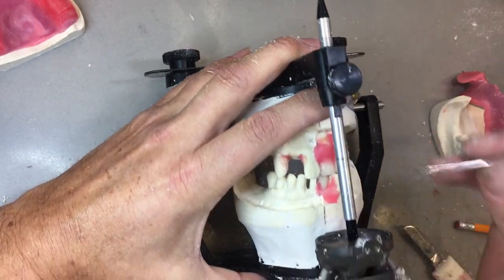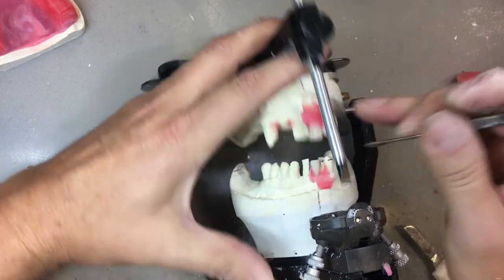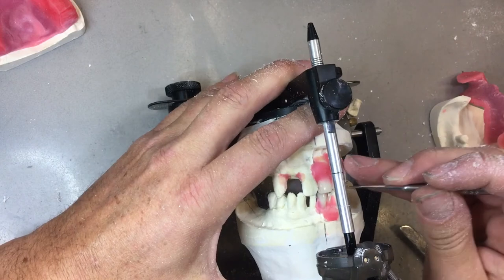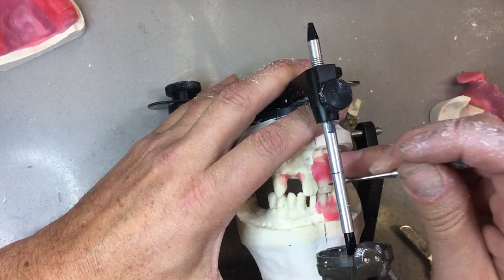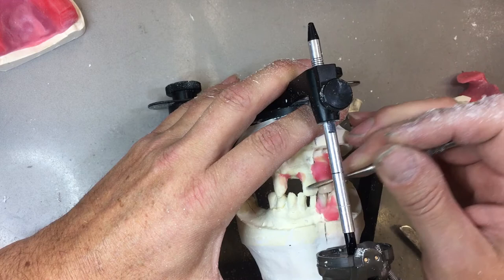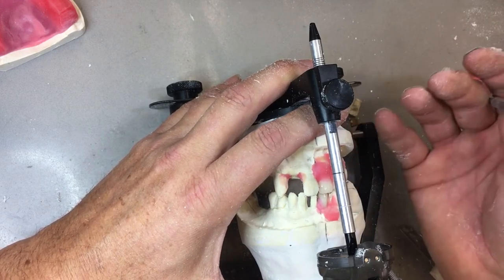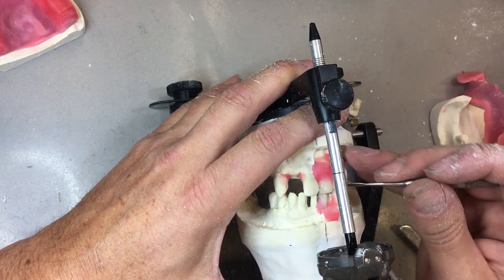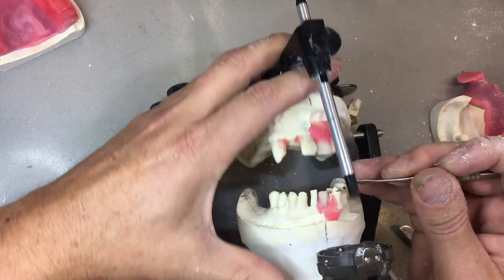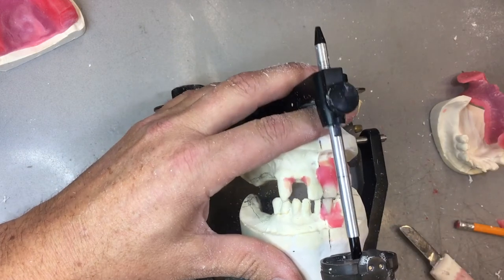This is almost a class two — my overjet is about 3mm. I'm going to bring this central in just slightly. This is probably the more critical stage right now, because once you have this anterior arrangement defined with overbite and overjet, things are kind of set for the posterior section. If I don't have this created correctly, then I'm into changing the occlusion.